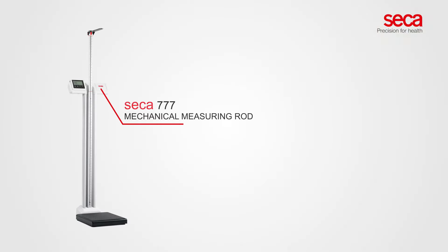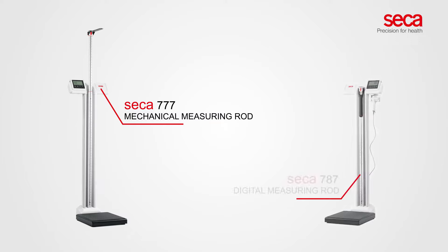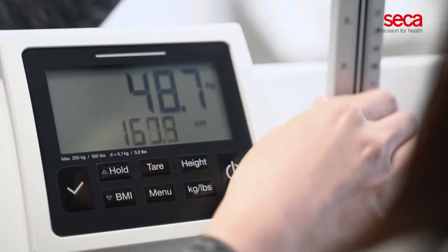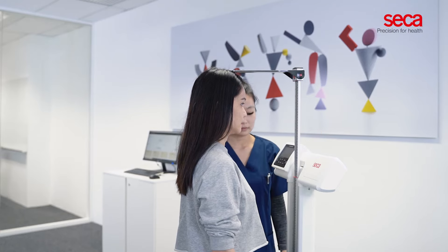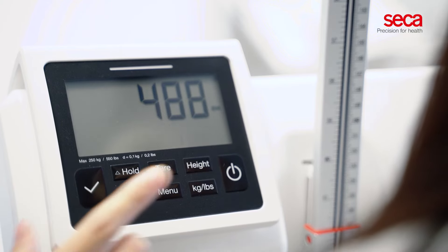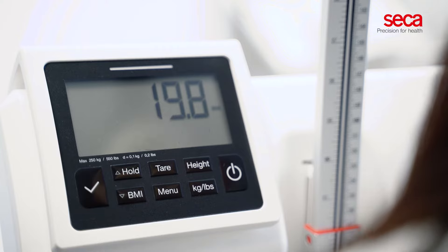The CECA 777 comes with a mechanical measuring rod. The CECA 787 is equipped with a digital measuring rod for even more convenience. Both extend up to 230 centimeters each. You can also calculate a patient's BMI with just a single press of a button.